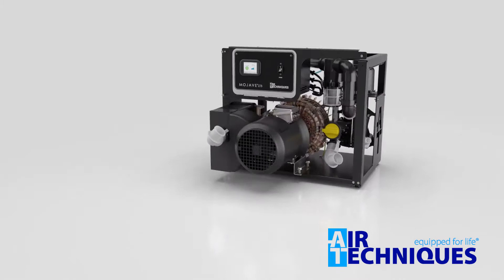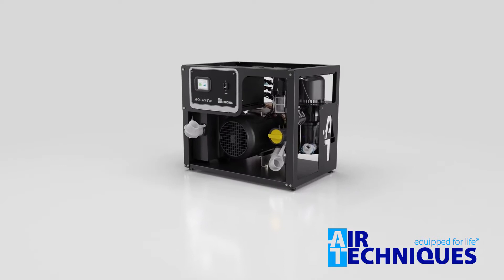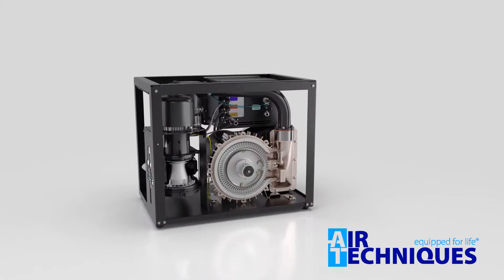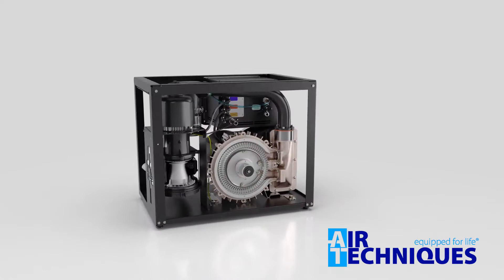Most of the time a dry vacuum system requires a separation tank. We remove the tank altogether and replace it with a robust motor-driven air-water separator — you can see it over here. What this does is separate the fluids from the air and allow them to drain out without making their way to the air pump.